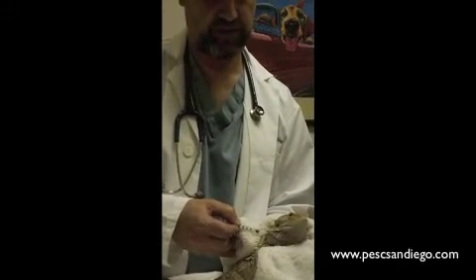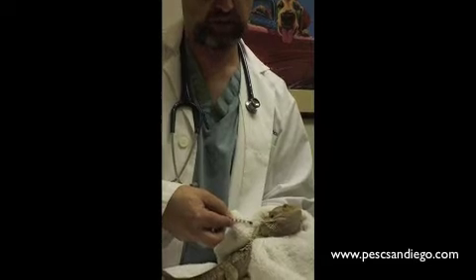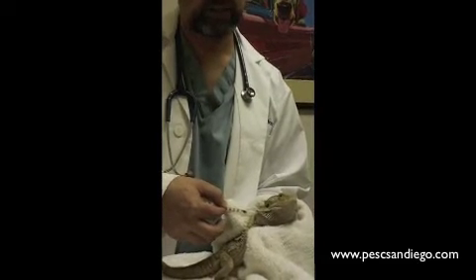And once you feel it pop through the skin, you'll depress the plunger, inject the medicine, and pull straight out.